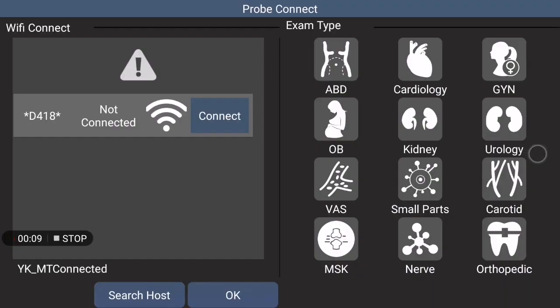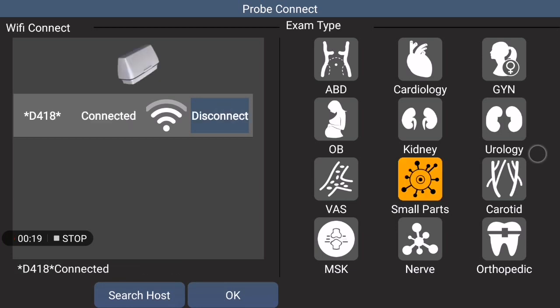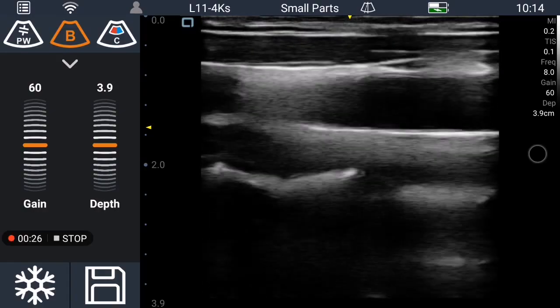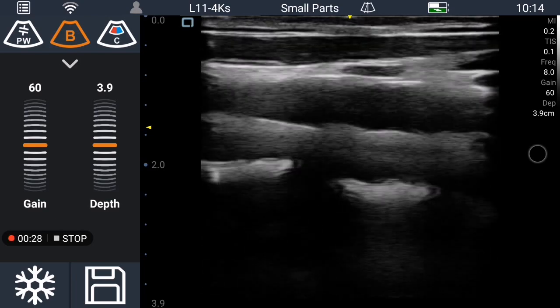Now I'll show you how to use the pulse wave function in our D8 UK wireless ultrasound system. First, you need to connect our wireless probe and choose the exam type and press OK.